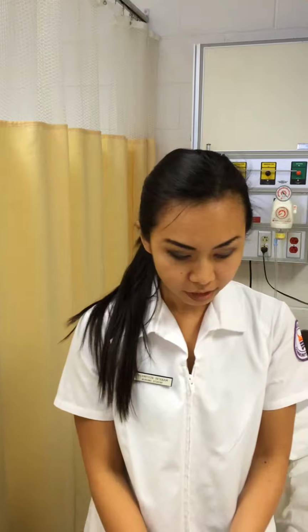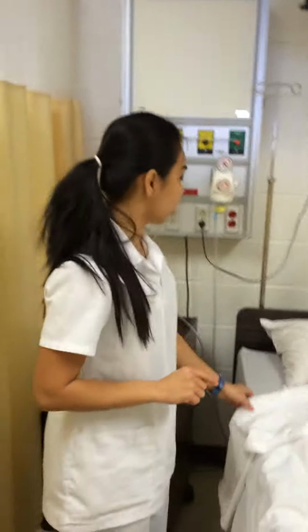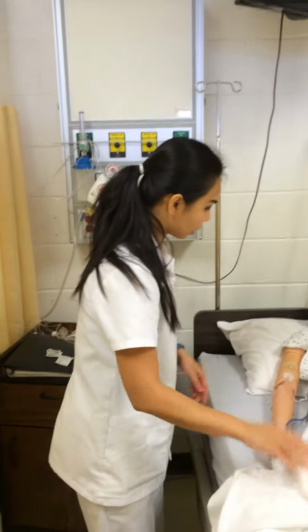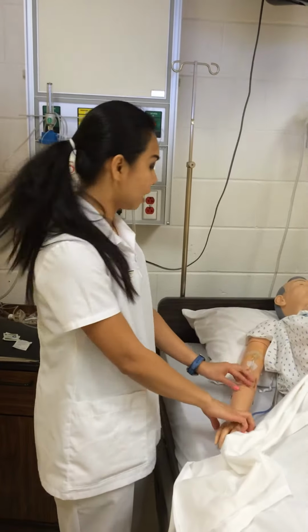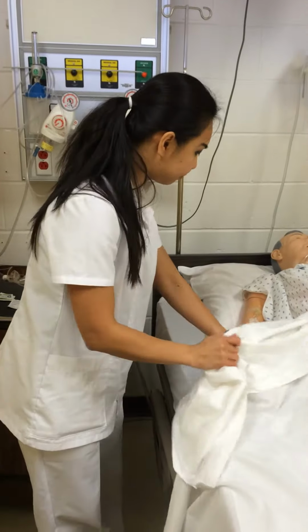Okay. So after I wash my hands, I'm going to check the patient. So I check the IV site, make sure there's no redness or swelling. So everything looks okay.